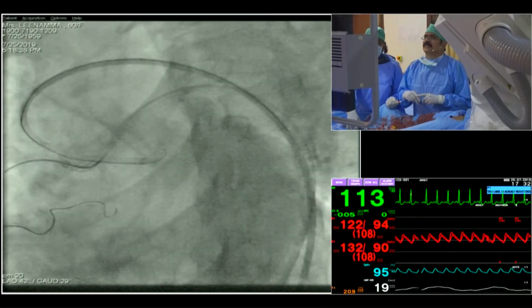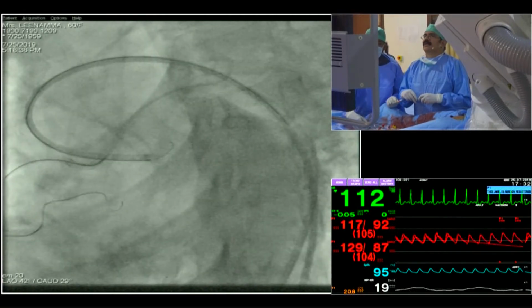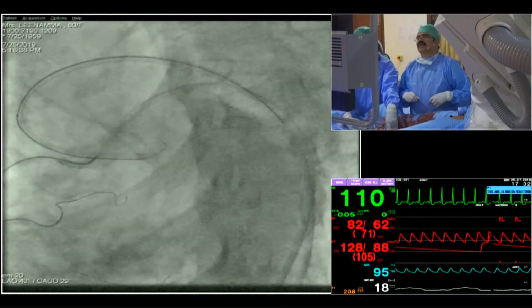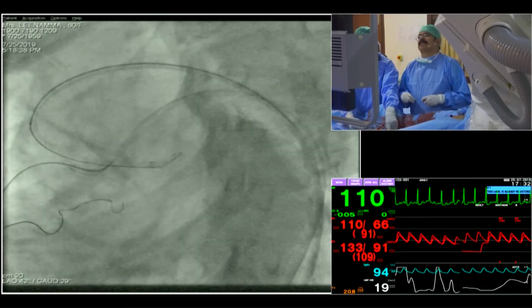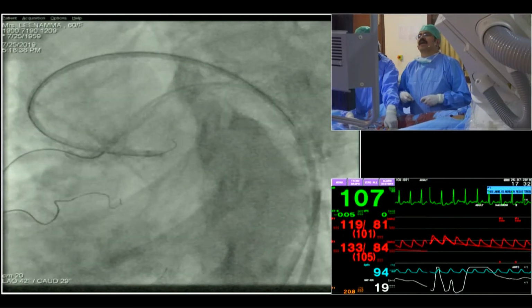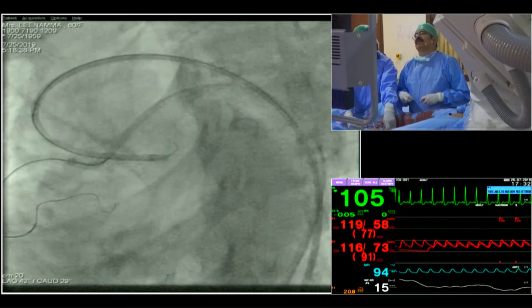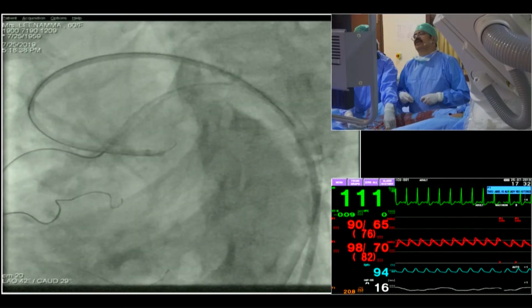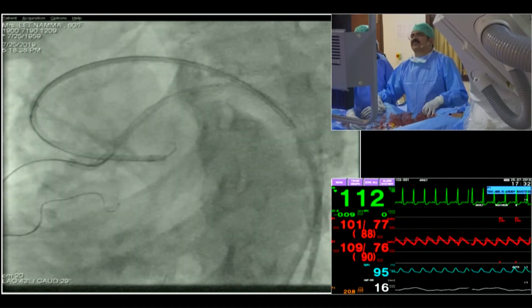You always take the help of a microcatheter like Tornus or any other microcatheter with this wire, or do you try before without that for free movement? Tornus, no. Yeah, some sort of support. No, I will always take a microcatheter for CTOs. You try sometimes even without the microcatheter? I always take. Always take, okay. Actually, in some situations I try with a microcatheter, and without a microcatheter also sometimes I try. If you feel that there is a high possibility that you can be successful, then I try with that also.